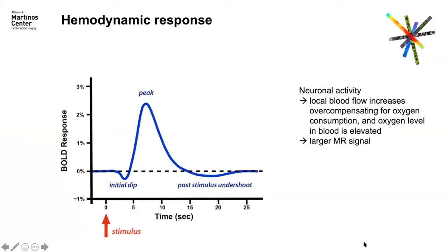This hemodynamic response to increased activity can be described with this kind of hemodynamic response function. It usually looks like this.